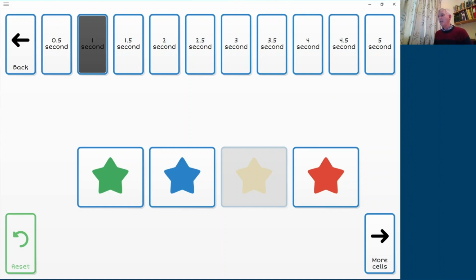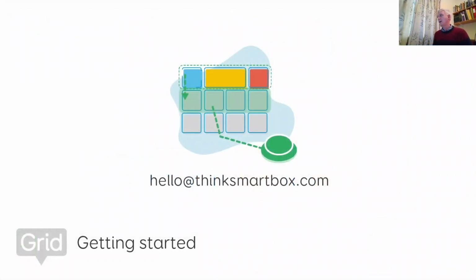So we've come to the end of this webinar now. I hope that's been a useful run through. Quite a lot there to take in. It'll be available on the website, so you'll be able to dip in and out of it as you want to. Do not be afraid to contact thinksmartbox.com for help and advice. We've got a wonderful support team who can walk you through and remind you of some of these settings. But again, I will just reiterate, when you're coming to fine-tuning someone's switch access, an experienced clinician in this area is worth their weight in gold.